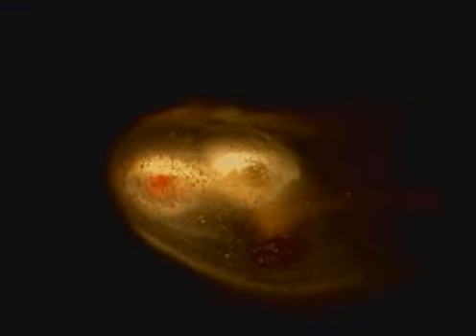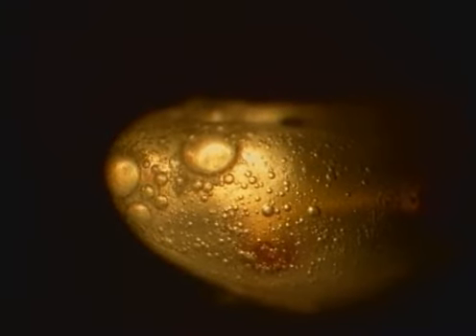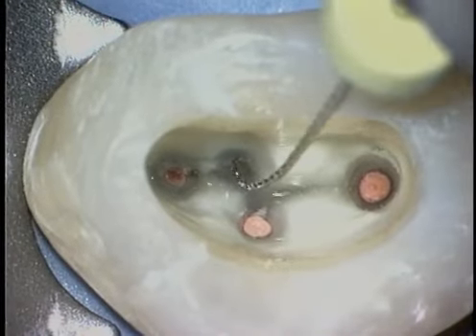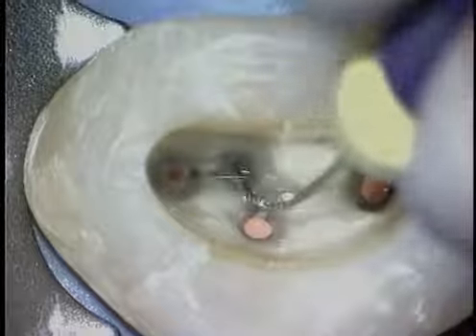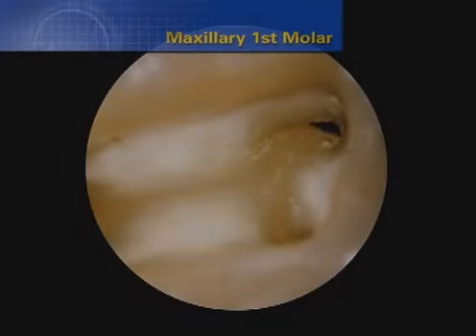occlusal table. When bubbles are noted, it usually means in this instance that sodium hypochlorite is reacting with tissue and liberating oxygen. The champagne test then can be used as a canal indicator. Solvent-filled canals are an opening for negotiating root canal systems. A working film shows the instrument at length.